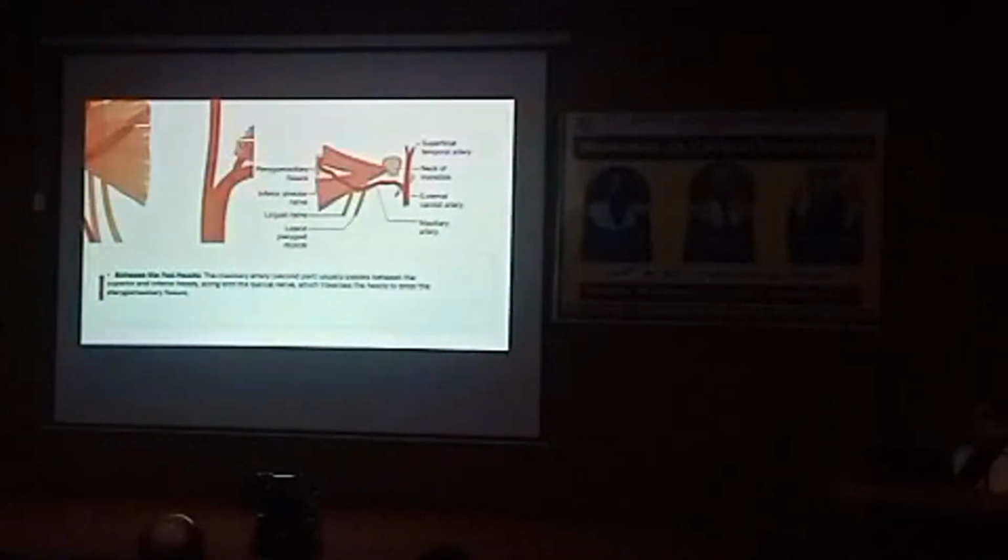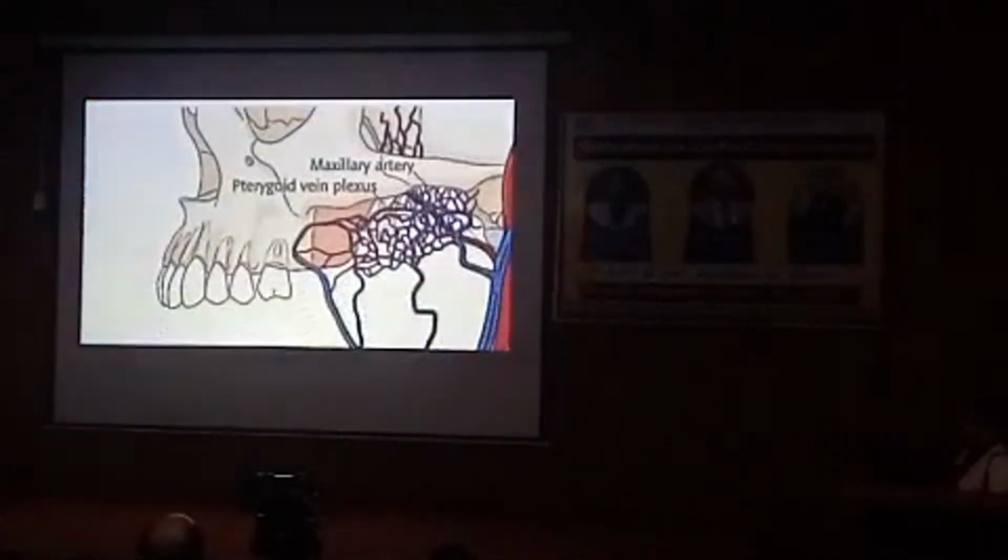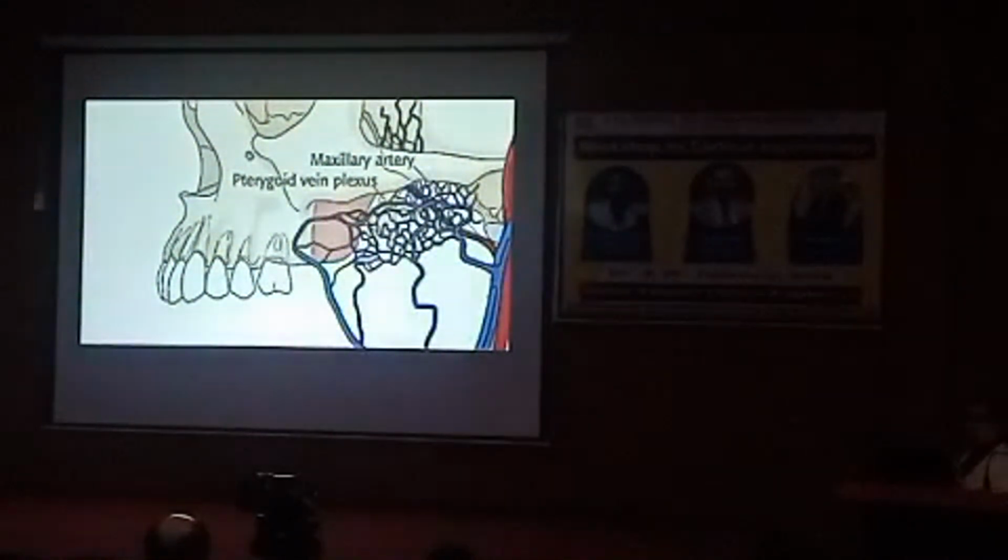अभी आफ्टर दिस मुझे ऐसा लगता है कि इतना वैस्कुलर स्ट्रक्चर, सबसे इंपॉर्टेंट आर्टरी और नर्व यहाँ पे पढ़ लिया, अगर टेरिगोइड करेंगे इनको हिट होगा तो फिर शायद हम फिर टेरिगोइड ना करेंगे. बट द टेक्निक से यहाँ तक तो हमने जानना नहीं. दैट इज व्हाई वी लर्न ऑल द रेंजेस ऑफ डिमेंशन दैट वी गोना यूज. वी शुड नो द एनाटॉमी बट वी नो दैट टेरिगोइड्स आर द सेफेस्ट इम्प्लांट टू प्लेस blindly.